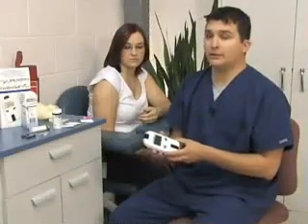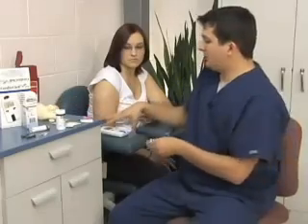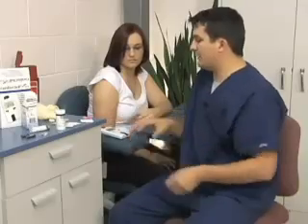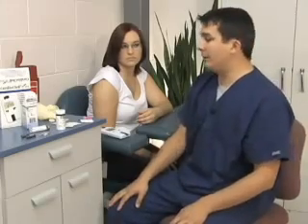After that it will display 'insert test strip.' In order to insert a test strip, take your vial and uncap it, remove a single test strip, recap the vial, and firmly insert the test strip all the way until it is seated. Once the test strip is inserted it will display 'apply sample' on the LCD screen. At this point you're ready to begin patient testing.